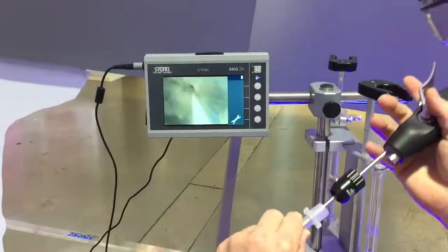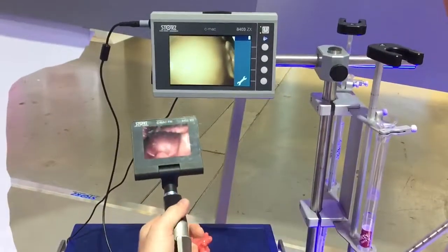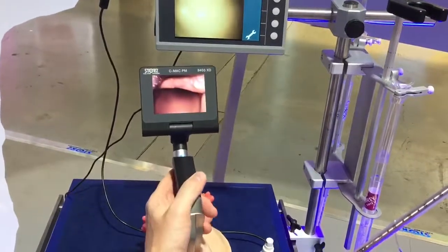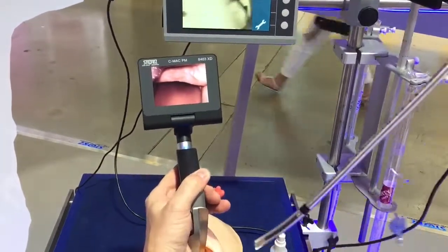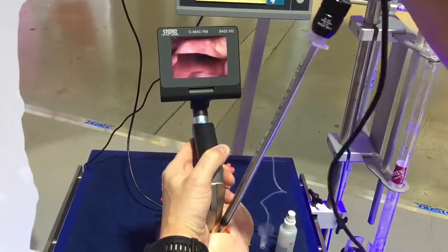That is presuming I've gone into my difficult airway and I actually was able to obtain a video laryngoscopic view. But if I go into my difficult airway and I get a grade 3 or a grade 4 view, now I can use the fact that I'm lifting the tongue and the base of the jaw, making myself space.